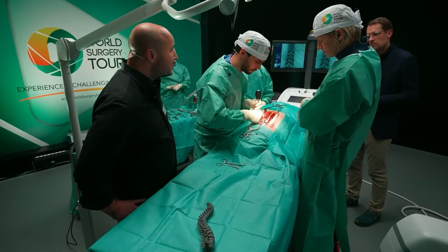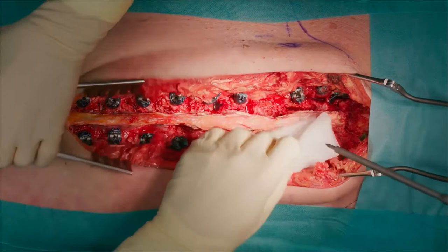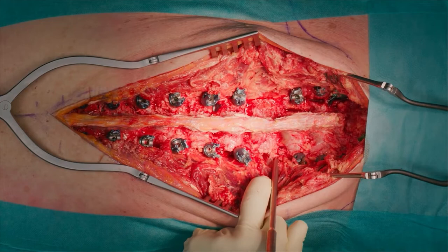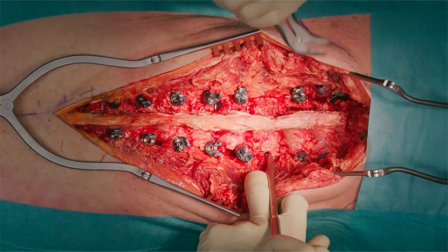Here at L4 the lordosis begins. Matthias prepared the transverse process very nicely, and now you will see very clearly the anatomical landmarks. This is the top part of the transverse process, this is the bottom part of it, and exactly in the middle you go in. And if you follow up, here is the facet joint. You want to stay lateral to the facet joint — so this would be the entry point.